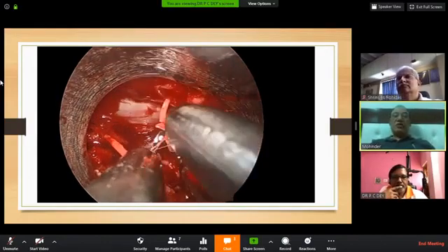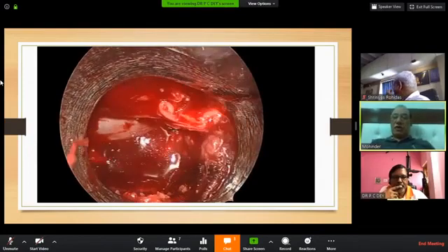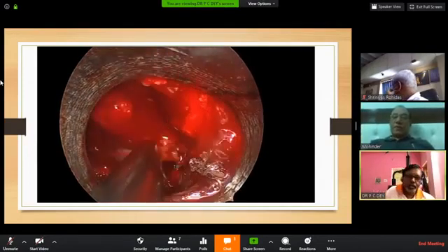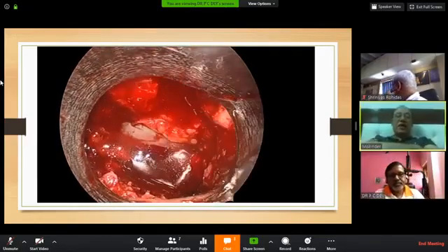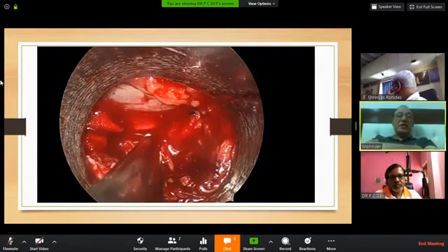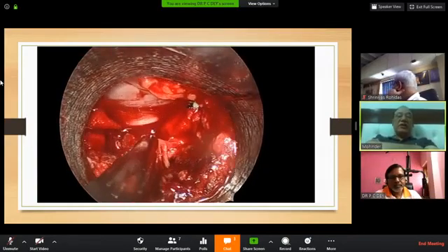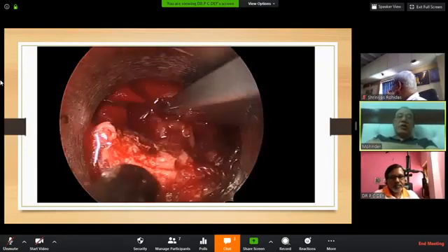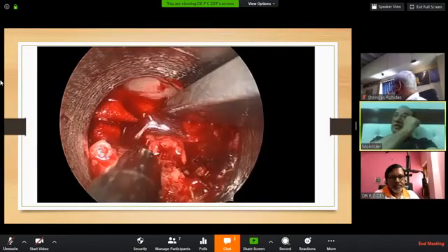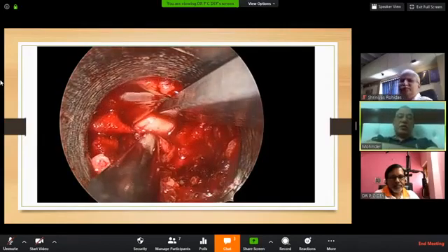But let's talk about controlling bleeding intraoperatively, that is what your question is. It is very rare also, sometimes hardly 2 to 3% of patients. So I use patties the way you are using. I use micro bipolar coagulation. And number three, in my cases it's a routine protocol: when we give a prophylactic antibiotic, we give Tranexa also preoperatively, on the OT table.